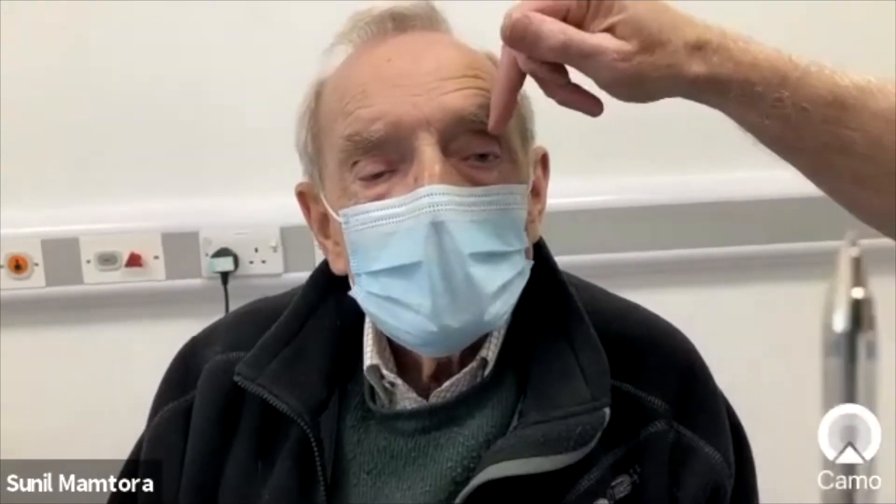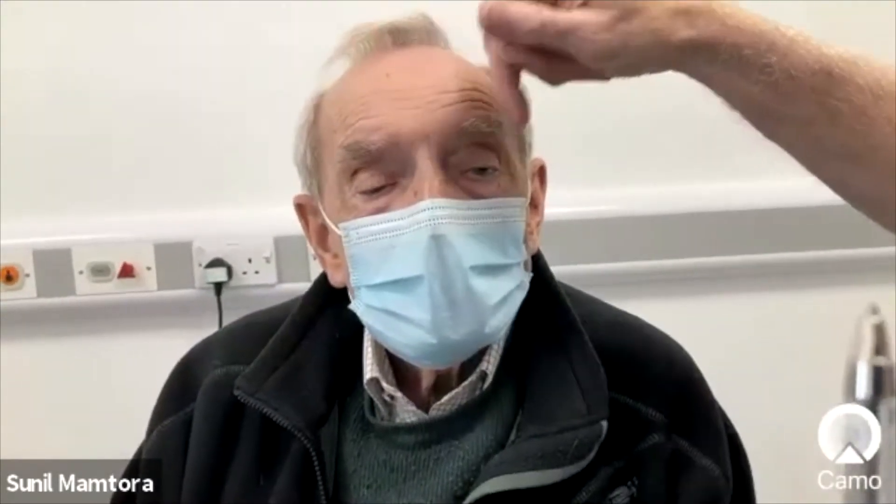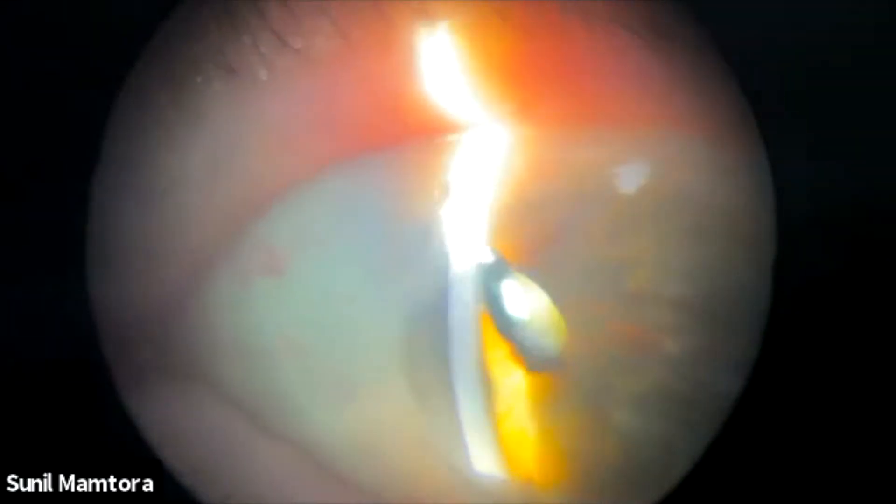For those watching, you can see there's actually a degree of bilateral ptosis. You can see how the right lid certainly bisects the pupil and the left is only just above the pupil. Something to look at is the height of the lid crease — the lid crease on both sides is elevated, more so on the right than the left, and that's been measured in clinic as 10 and 8 millimetres by Mr. Baker.